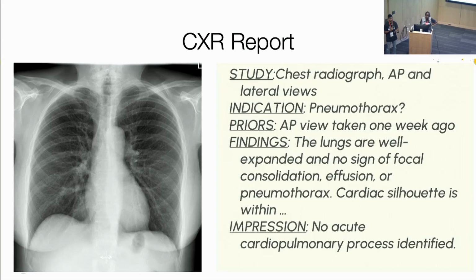So for the appendicitis example, if I'm a surgeon reading the impression and it says acute uncomplicated appendicitis, I know that that means the appendix is dilated, there's no free air, there's no abscess. I know that because of my training, but you want to give people an easier, more succinct thing to read, and if they need more details, they'll go back to the findings section.